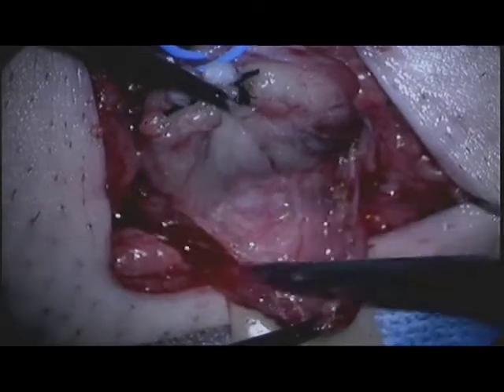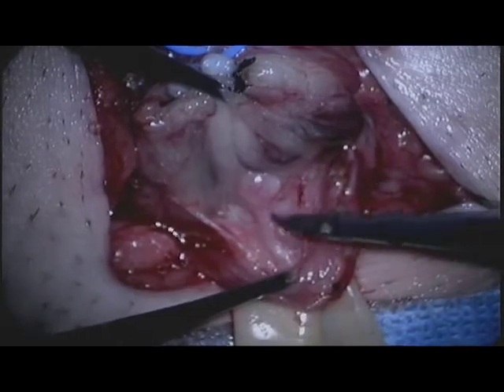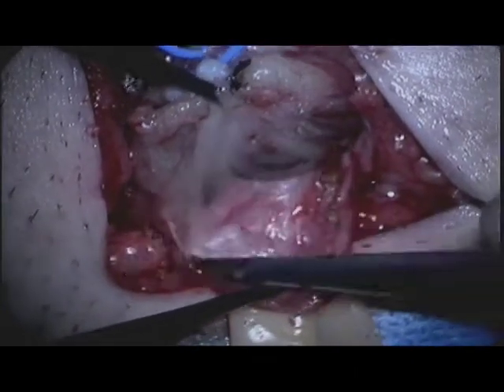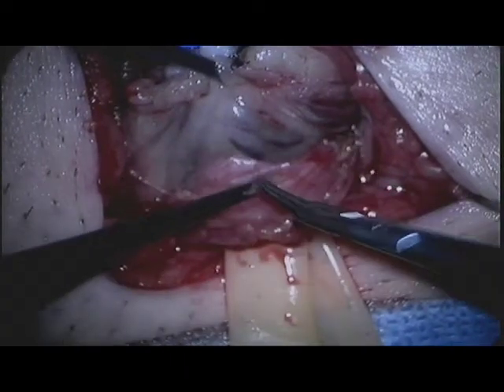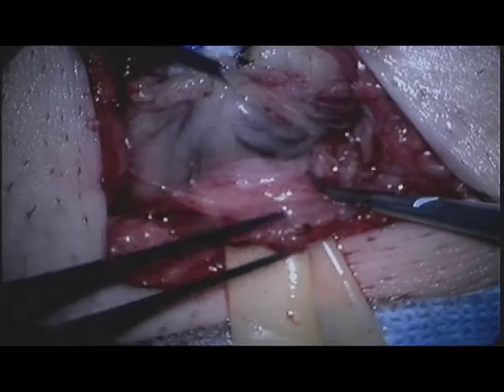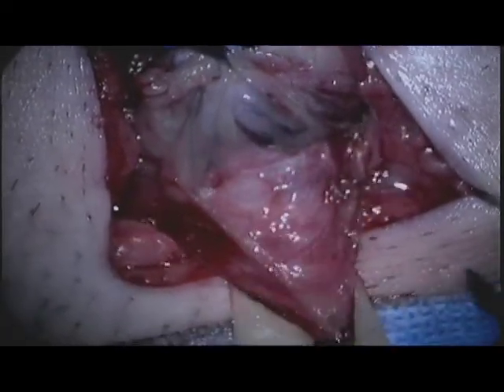Proceed with dissecting through the spermatic fascia, identifying any lymphatic vessels, and transecting the remainder tissue. This allows for better tensioning of the spermatic cord and therefore better visualization of these structures.